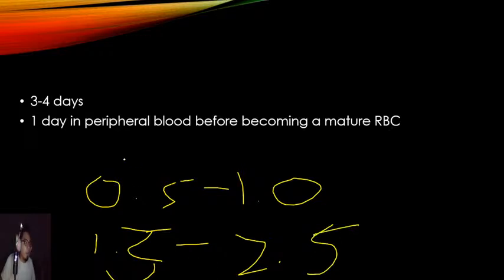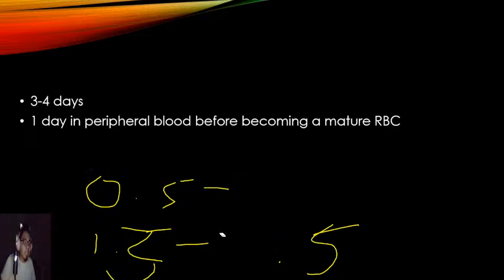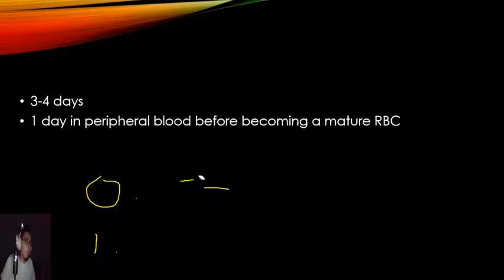But normal values change depending on the manufacturer of a particular automated analyzer or machine. That's just something that you need to take into consideration when you're doing reticulocyte counts, okay? It depends on your methodologies as well as the manufacturer of your automated analyzer. So it doesn't necessarily mean that you have to memorize these things, okay?